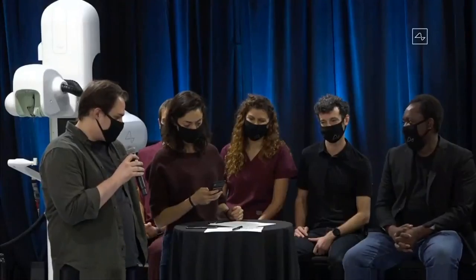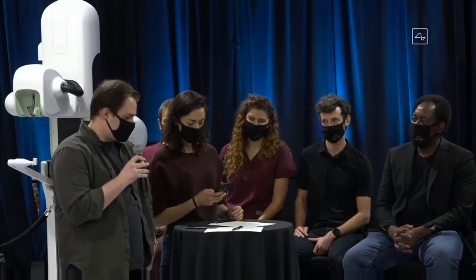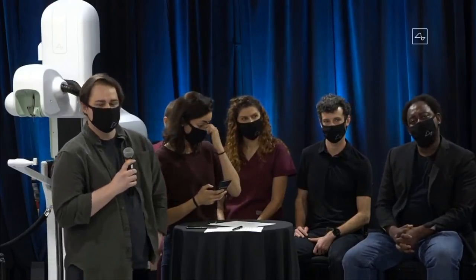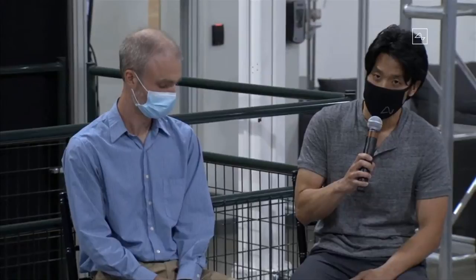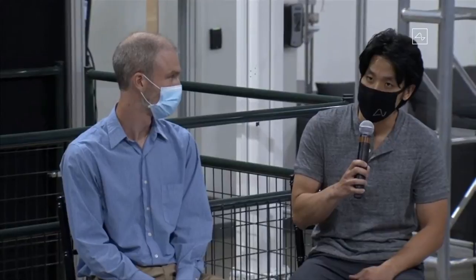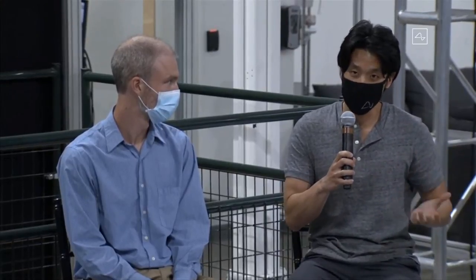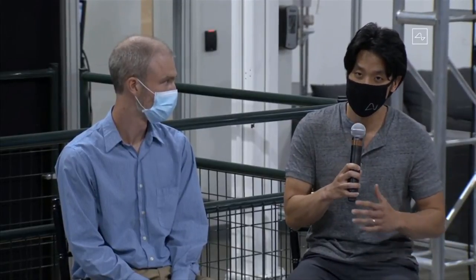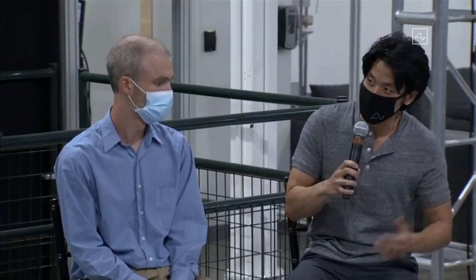Cool. So Twitter asks, how does the implant system fare against various disturbances from the outside, like electrical, magnetic, Wi-Fi, radio? Yeah, so the current version of the implant that we have is using Bluetooth low energy radio. So similar to any Bluetooth devices that are out there, they are able to coexist with other devices that are using and sharing our same spectrum in 2.4 gigahertz. Obviously, as you imagine, when you go to concerts or there's just a lot of people, the signal quality does degrade because it is a pretty congested spectrum. So we are working on some new versions of the radio that are operating at different frequencies to be able to also send out a lot more data and have it be scalable to millions of electrodes.